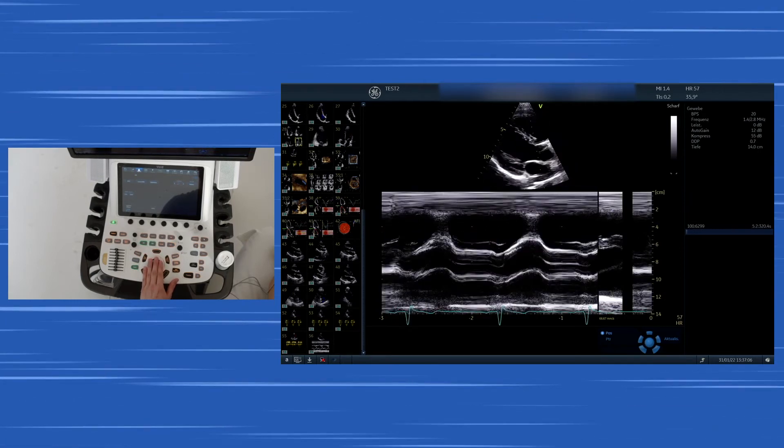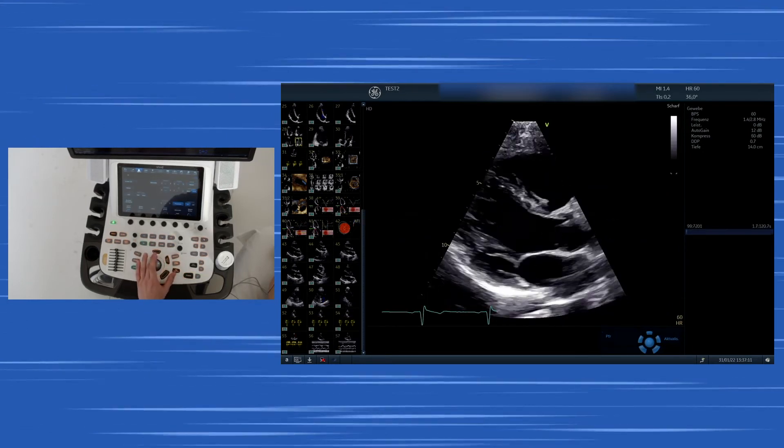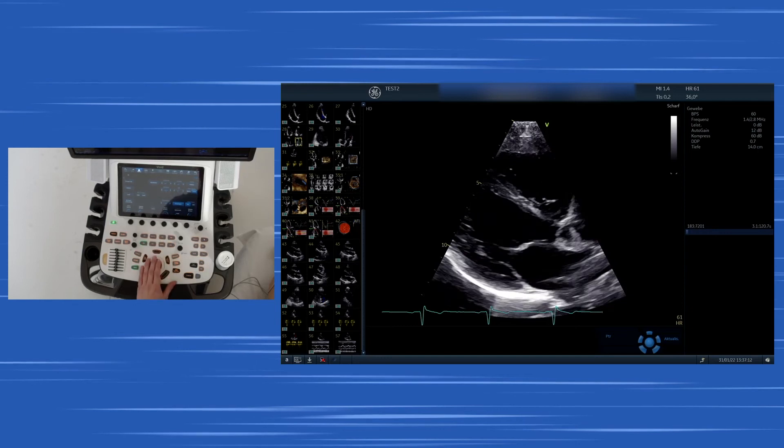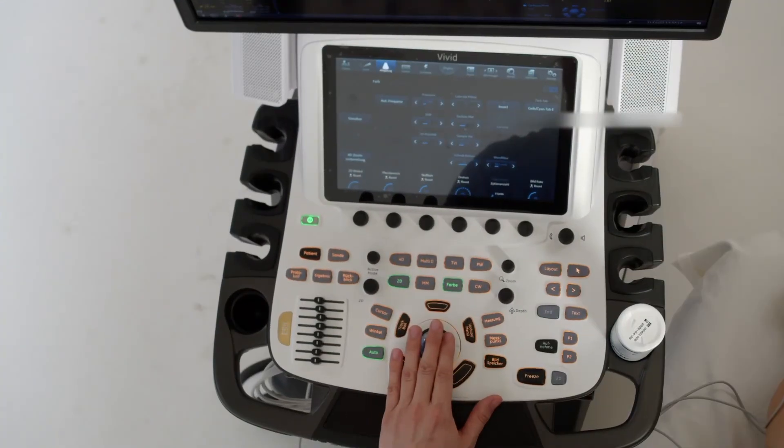Saving all those images, continuing with color Doppler on the aortic valve and the mitral valve. You always should use the color Doppler on both valves individually and also on the tricuspid and the pulmonic valve.